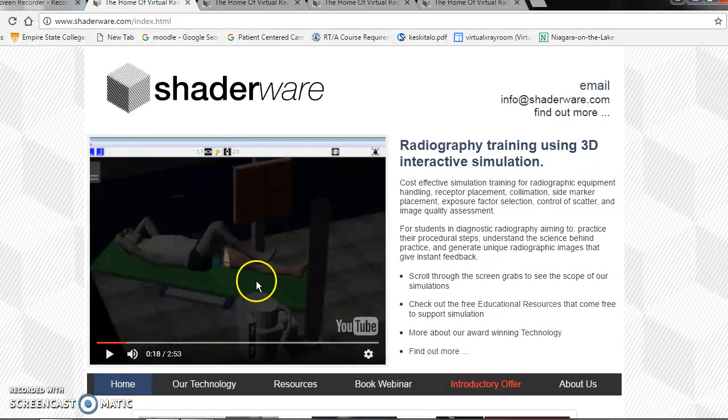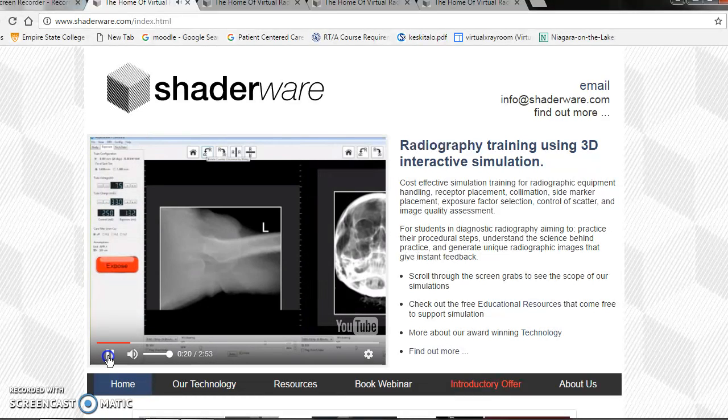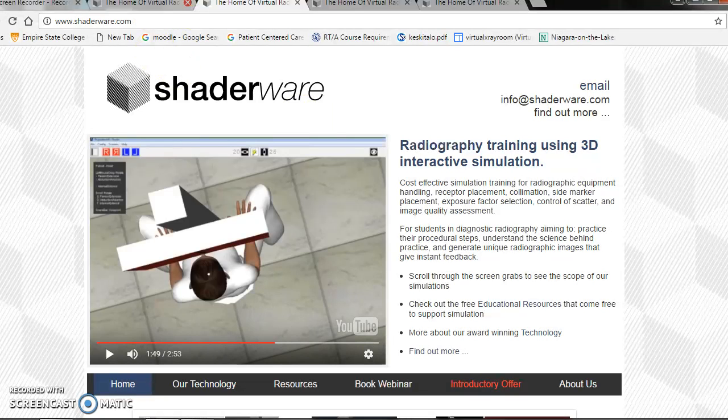And as you can see right here, the lights did dim and they activated the light field here for where we're trying to acquire an image. And to do that particular movement, you would click the light bulb, which I'm pointing to right here in the upper right, and that would actually allow you to manipulate the light field going to the spot that we're actually doing. All right, so moving on a little bit here, you can see the light field, and now we're actually acquiring an image. All right, so I'm actually going to move on to patient rotation.